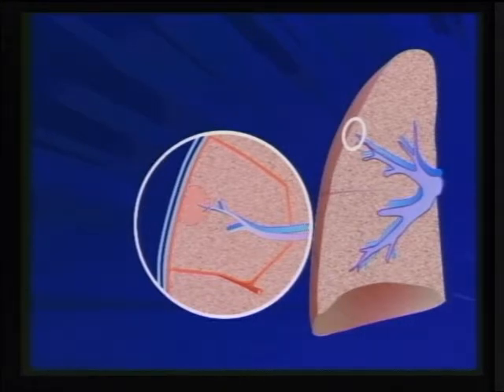Then, of course, the secondary pulmonary lobules themselves represent a conglomeration of acini. The acinus, and you remember the acinus disease. This is a disease that reflects the size of the acinus, which is anywhere between 5 to 8 millimeters. And in very early airspace disease, as we're going to see, you'll be able to actually recognize the acini and say, okay, this is the configuration of the acinus. That means that this is alveolar disease or early alveolar disease or minimal alveolar disease.